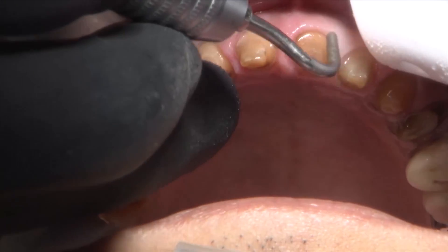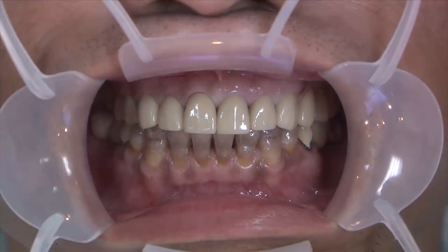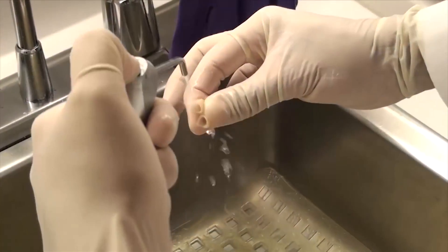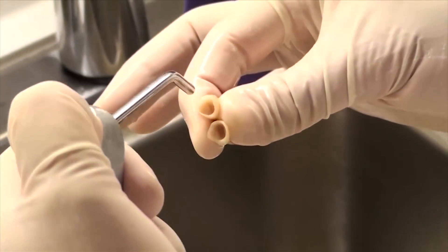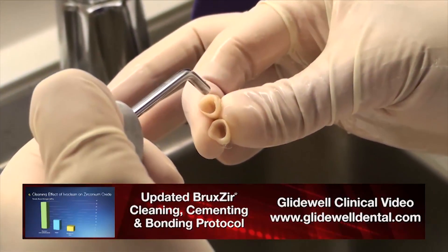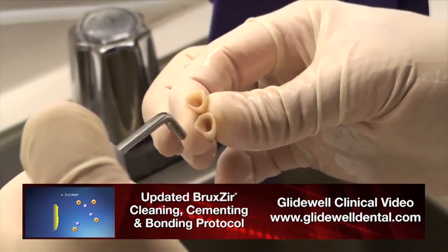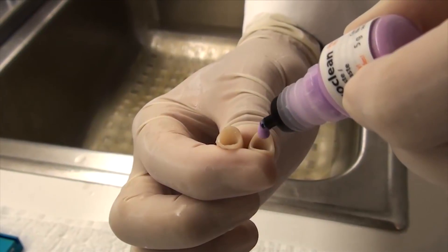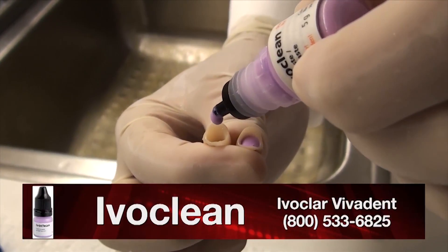The Kavo sonic scaler — no better way to clean up a tooth after temporization. Every little bit of temporary cement comes off so you don't have fit issues. We're going to try in the Bruxer crowns. The patient liked what they saw, and once they've been tried in, we know they've been contaminated with saliva. I can rinse them out with air and water and they may look fine, but I know that the salivary phosphate groups are still bound to the zirconia oxide on the inside of the crown.